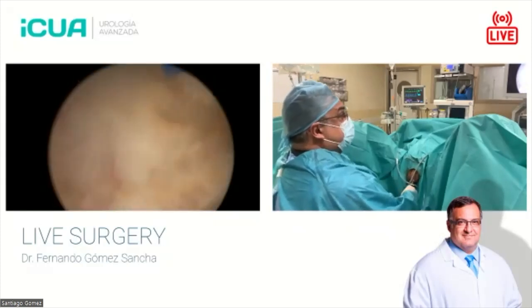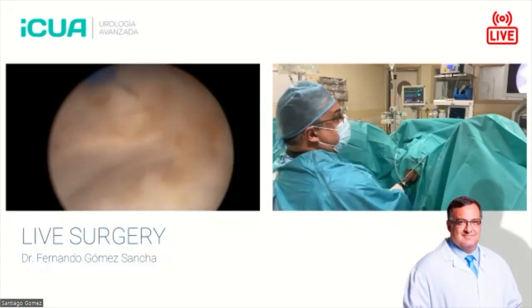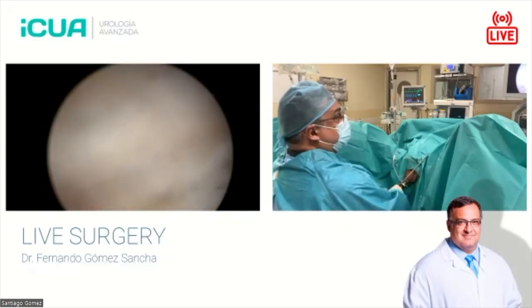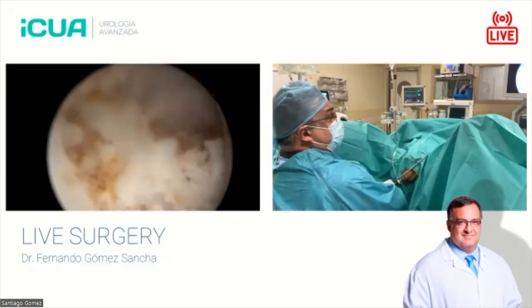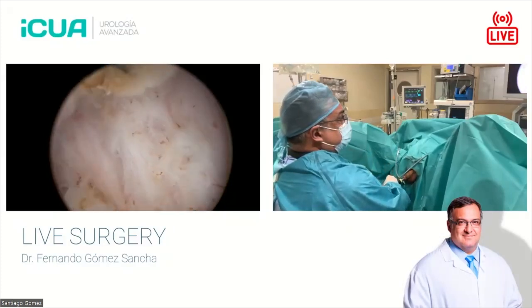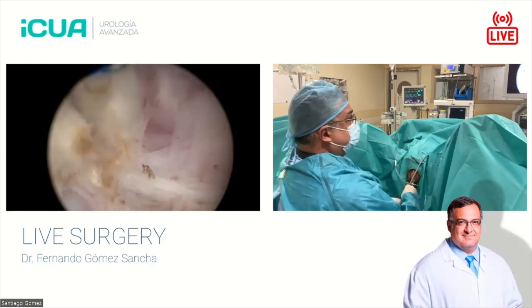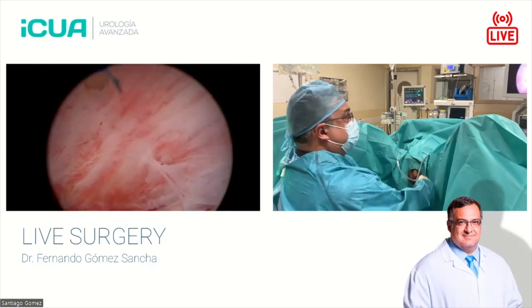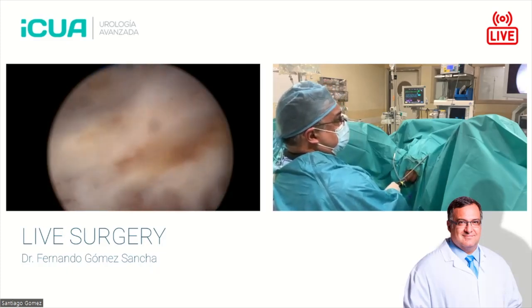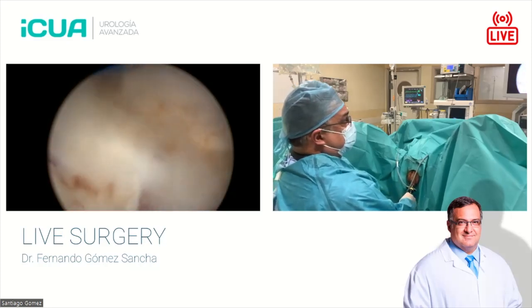So yes, but I haven't tried other instruments for a long time. I think there are very nice surgeons doing surgery with different instruments. So I don't know, what is your experience, Marek, with different instruments? What do you like? I really like the Wolf, and I also tried many times the MILEP. Philippe introduced this 22.5 endoscope, and it has a little bit steeper tip of the endoscope, but it can enucleate very well too.